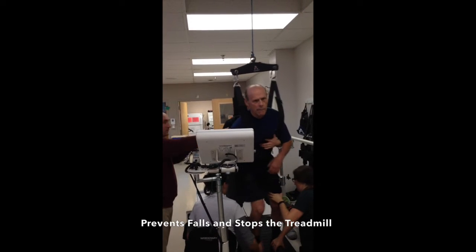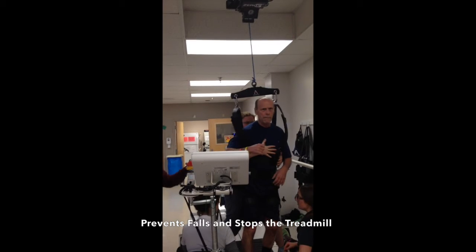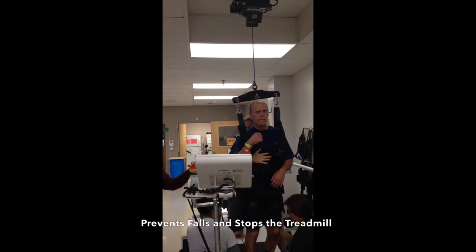For ultimate safety, if a patient were to fall, Zero-G Lite will catch them and simultaneously stop the treadmill.